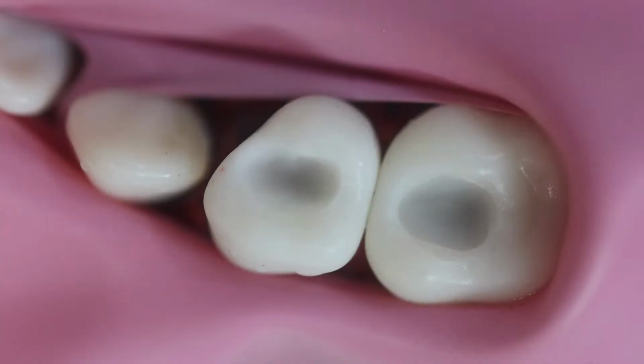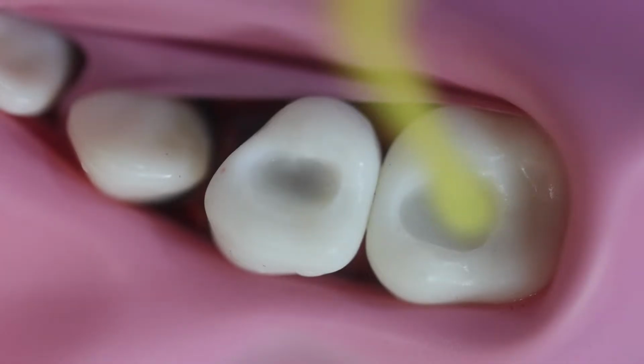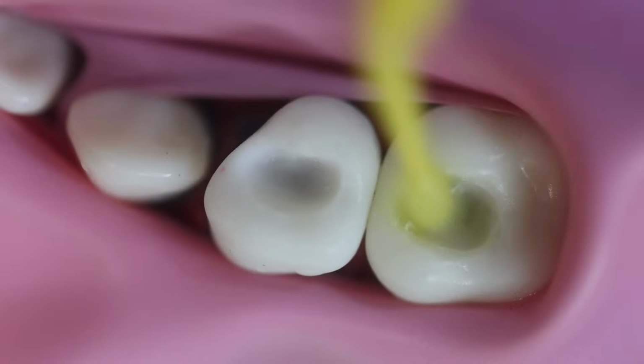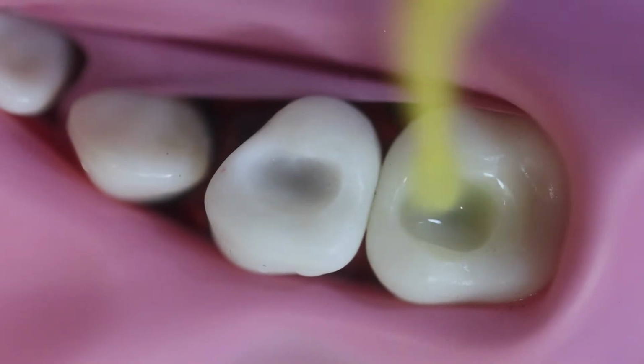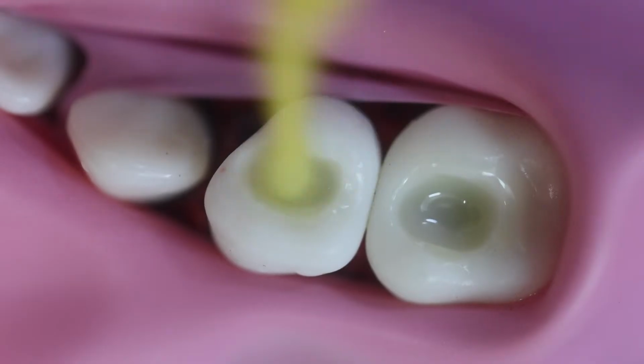Hope you are able to appreciate the shadow of the pulp tissue beneath both these molars. Now we are applying the 7th generation bonding agent, so we don't require an etchant. You have to scrub the entire surface.